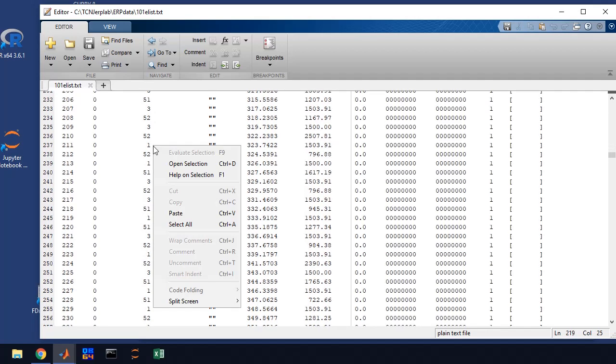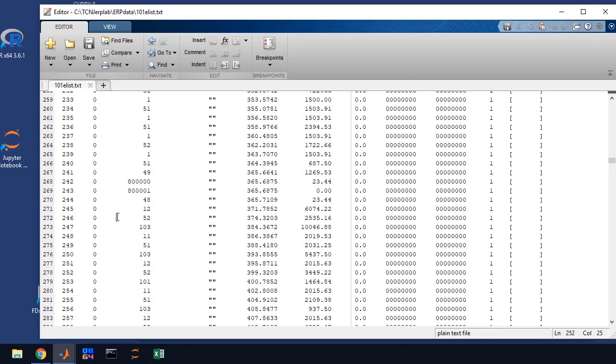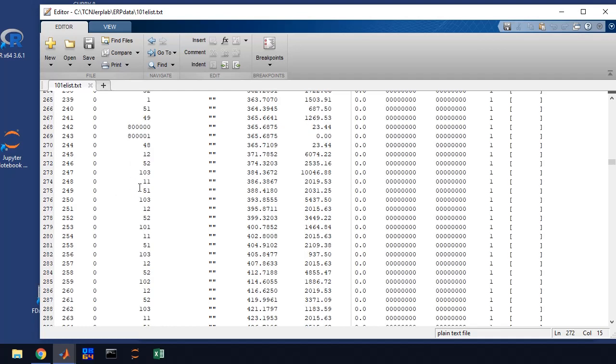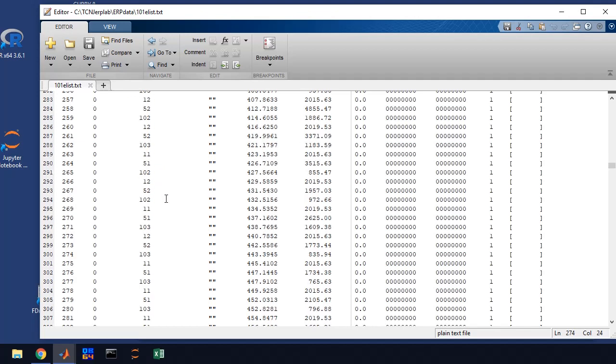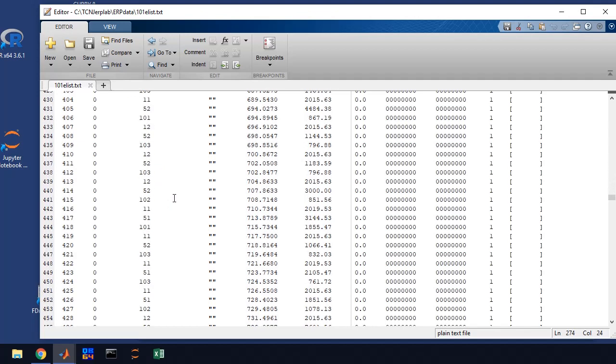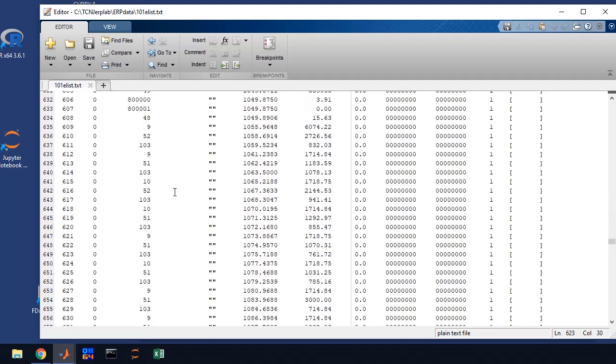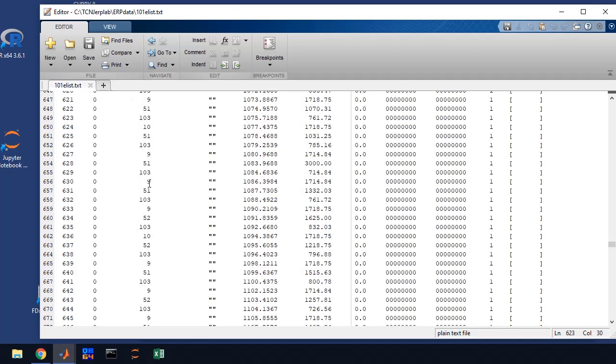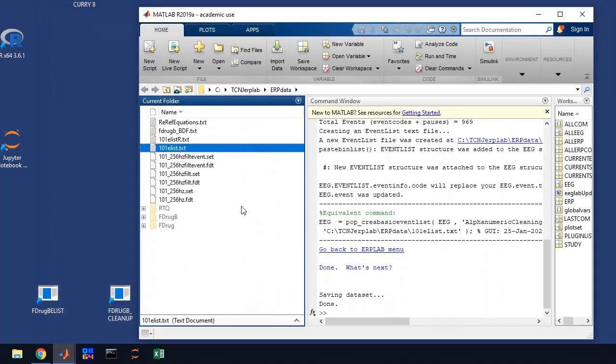So this is the study phase and that continues for many trials. And then we'll see a boundary here. That's where the recording software paused in between study and test. And then it resumed. And so we have a test. So this is our first test trial. That's a code for the type of trial that it is. This is an event code for what the response was. So 51, 52 in this case were older, new judgments. And then we have 103 is our confidence level. So we have 100, 101, 102, 103 are our confidence levels. And then we have the next trial. So this continues. This is all of our event codes that have been created. And you'll see another boundary. And this starts our second memory test. So we had a study phase, two separate memory tests in this particular study.